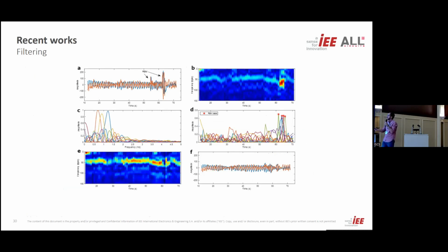So this is just one of the results. We have the original signal with random body movements, the original spectrogram, and those are the W and H matrices. When we look at the time activation matrices, we can see these strong components, which are sparse. They are only strong in this part. Most of the time, they are close to zero. We can rebuild our spectrogram, and then we have our clean signal here.